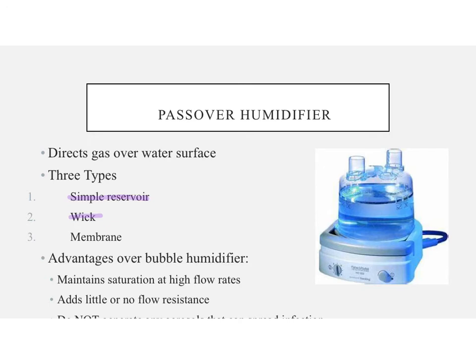With these, there is no bubbling. If there is no bubbling, then there's no aerosol. So there's a decreased risk of infection because there's no aerosol.